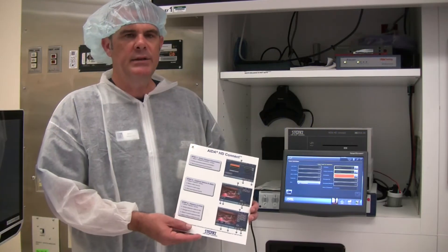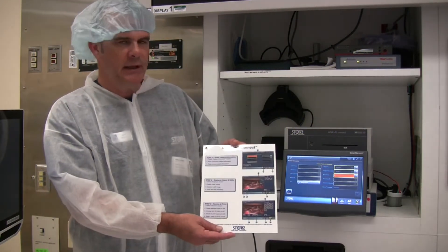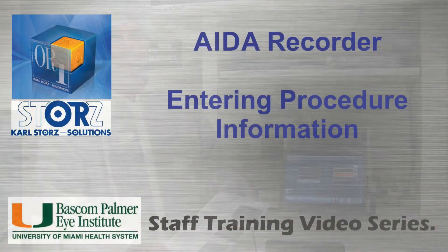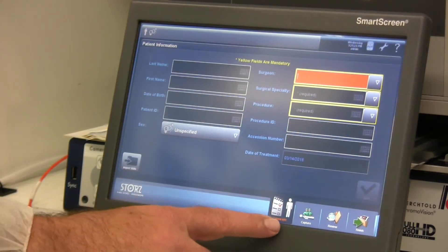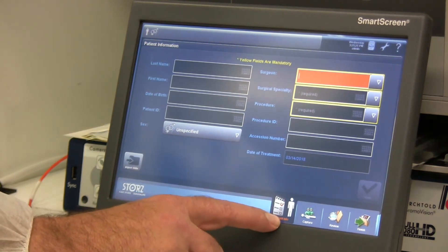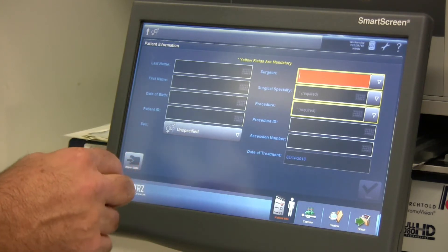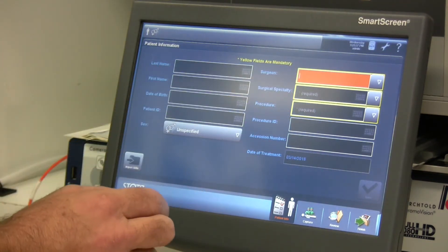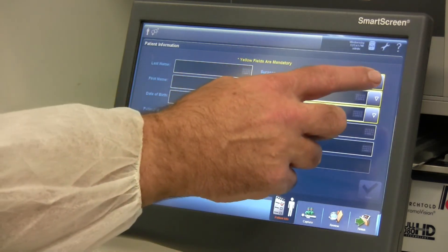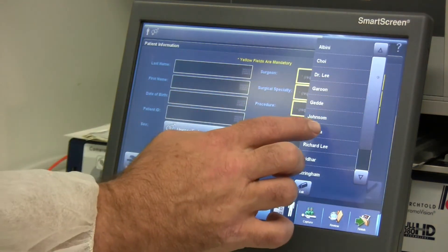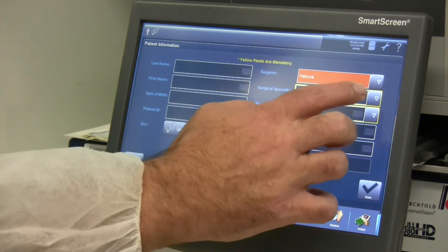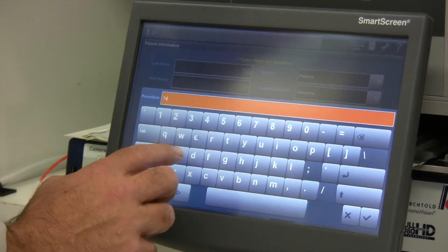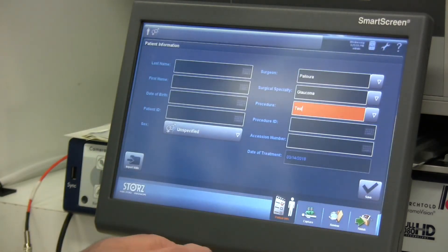Now we're going to talk about the AIDA HD Connect image capture device. In each room there is a detailed laminated cheat sheet that goes through each one of these steps. The first step to image capture is selecting the patient type. When you select this button, you'll see areas to enter patient information — patient name, date of birth, etc. There are three areas highlighted in yellow that must be filled in: surgeon (tap the arrow for a drop-down), surgical specialty (select from a drop-down), and procedure type (type it in). Click OK and you're ready to move on to capture.